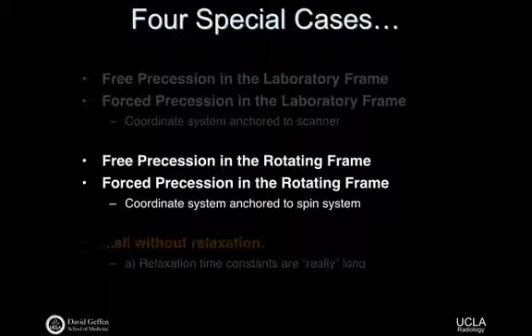Now we have a term hanging out in the x component, and it means that our x and z components will be coupled, but our y component will be out of the picture for this specific case. I'll work through some of this, but I probably won't work through how we get to the solution too carefully. From this system, again, this represents a system of differential equations.